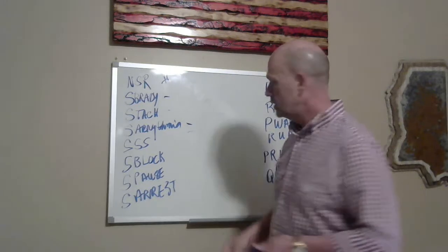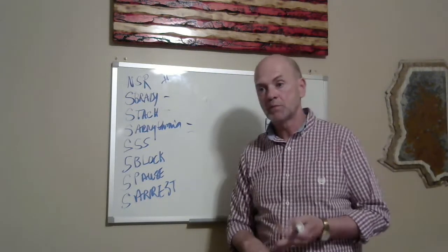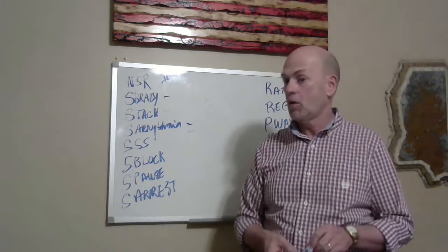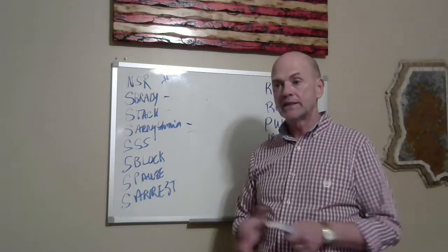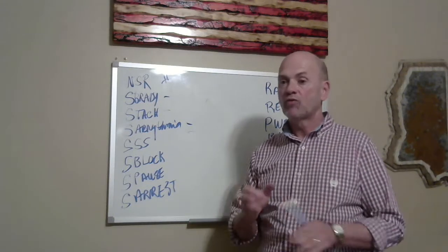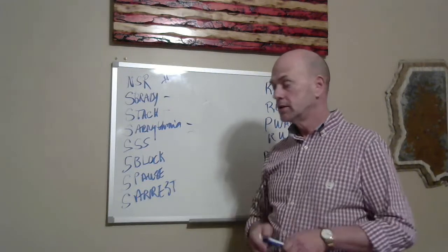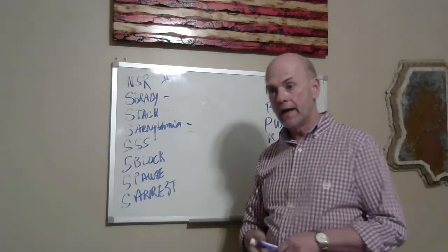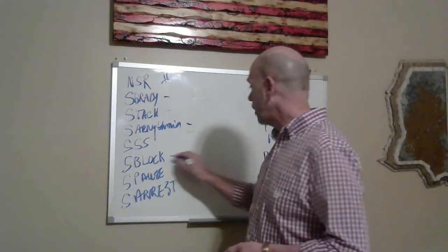Well, there's only a few more. Sinus block, sinus pause, and sinus arrest all almost look the same, and what differentiates them is how frequently or infrequently the pause or the block or the arrest has occurred and when it starts back. I'll do sinus block first.